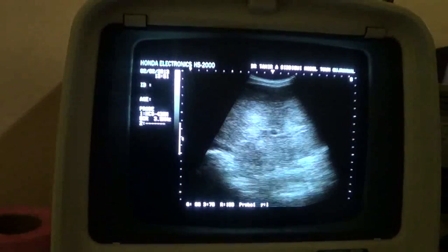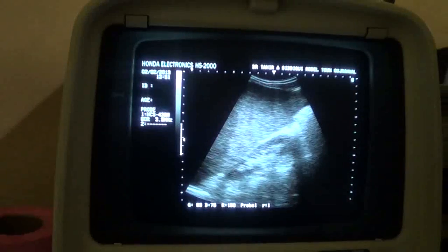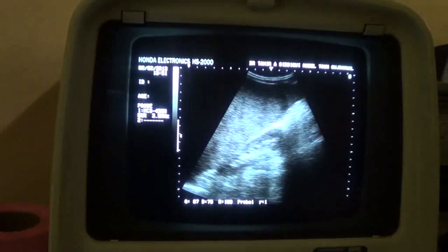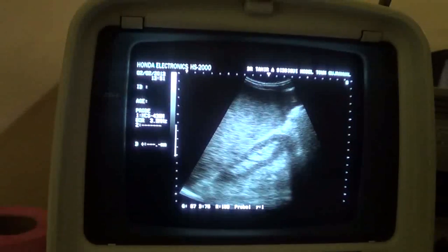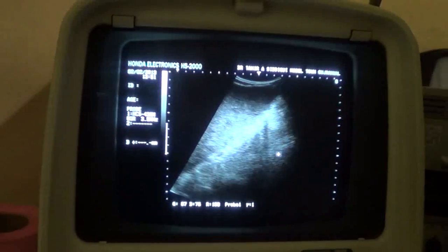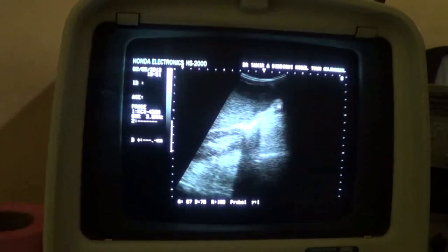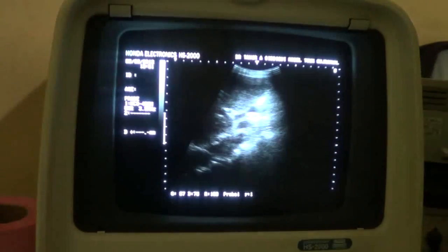and the liver is enlarged. It exceeds the lower pole of the right kidney. It is seen below costal margin. It exceeds the lower pole of the, this is the lower pole of the right kidney. There the liver is exceeding it, and liver has rounded angle, you see.